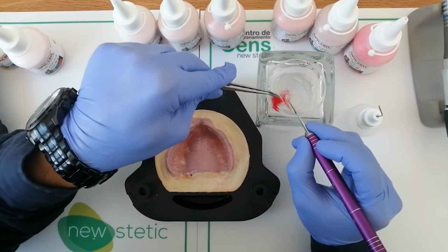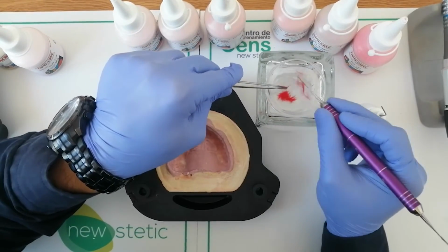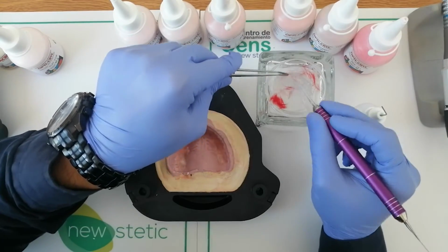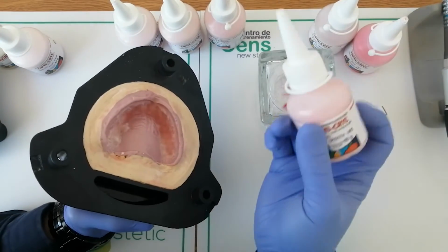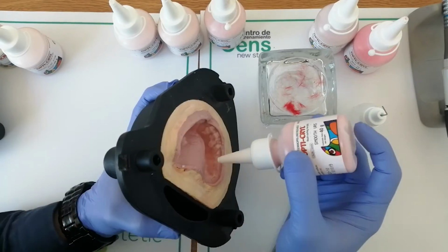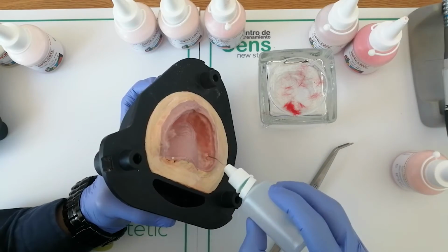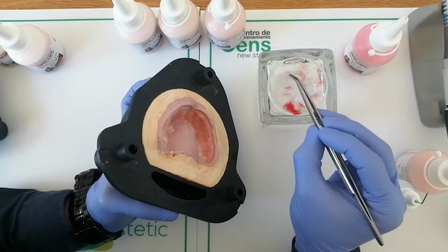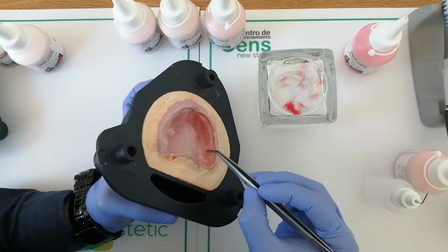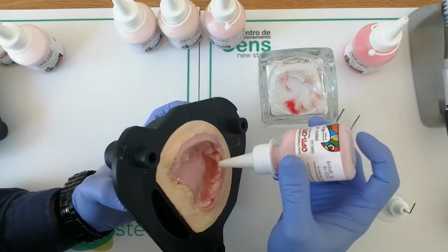Take a small portion of the filaments contained in the kit, red fibers, and then separate them little by little as shown in the video. Place a small portion of VR5 color for the zone of the bottom of the groove. Hydrate with Opti-Cryl heat-curing monomer and then place small amounts of filaments only on this zone. Place the smooth VR5 polymer again, and then hydrate with monomer.